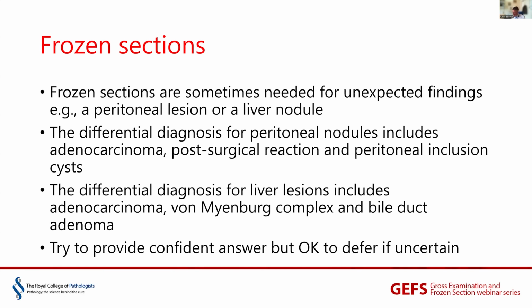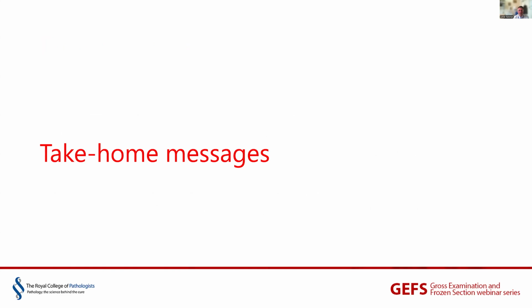So, as with any frozen sections, try and give a confident answer if you can, but if you can't, you sometimes have to say, I'm not sure, this is suspicious, I'm going to have to defer to paraffin sections, and then the surgeon will need to combine what you've said with his or her own level of clinical suspicion.